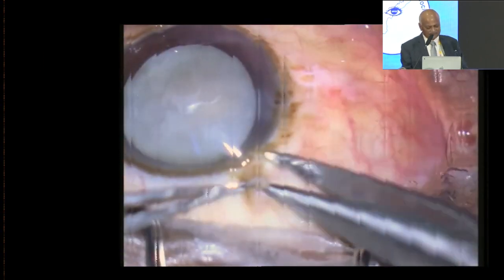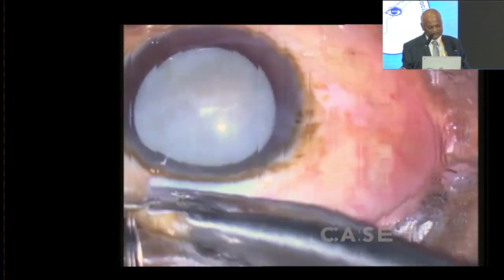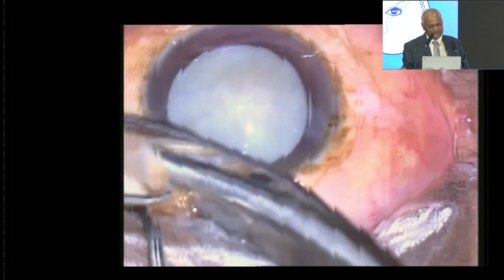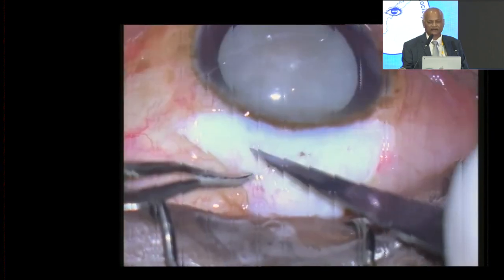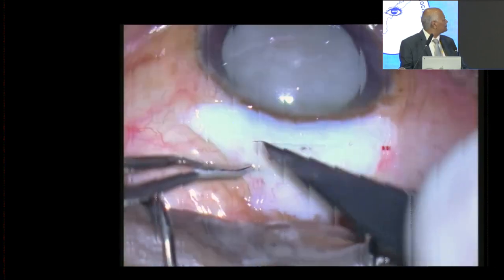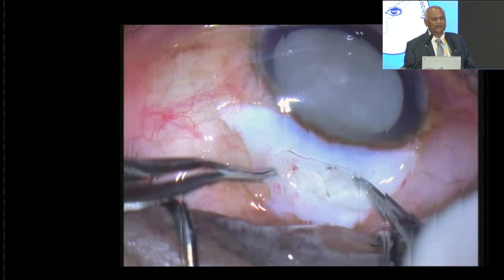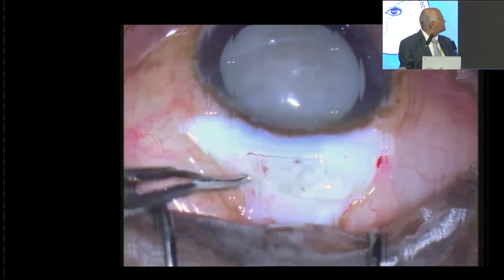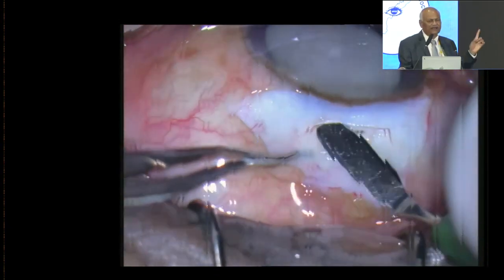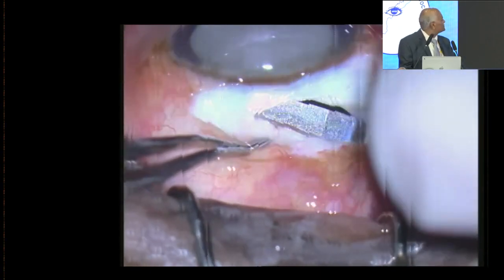Now see the SICS incision. See here the conjunctiva: you must cut the conjunctiva properly, and you must reposit the conjunctiva, otherwise the patient will get irritation. What I am doing here is a modified Frown incision learned from Blumenthal. On both sides there are back cuts, so that the nucleus also has the breadth, not only the thickness.